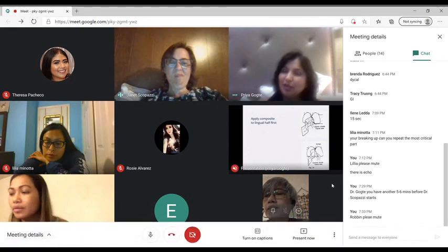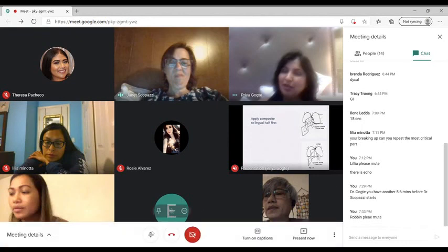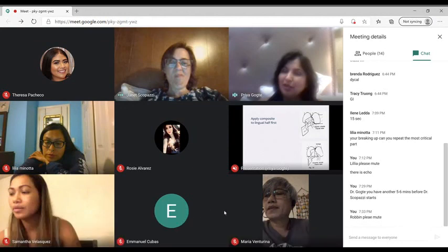Yes. If you look at my video, I was talking about, because of the C factor in the polymerization and the shrinkage, there are some lights that are pulsating. There are others that go 5-10 seconds. But also the quality of the light. There are some lights that are super, super strong and they just cure. Of course, you want to use a lower setting. So it depends on the light. Yeah, and make sure you check your lights often.